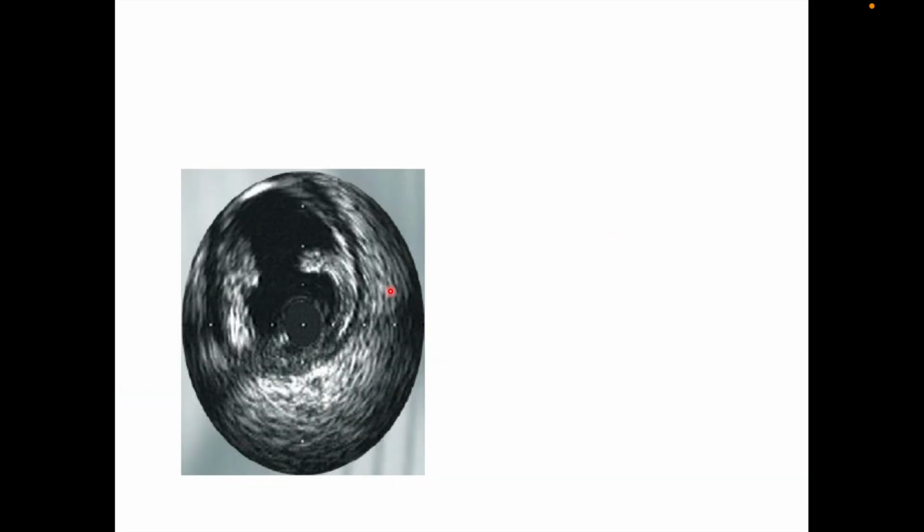So how do you identify dissection? Here, if you start identifying structures again, this is the IVUS catheter, and then from the IVUS start going backwards. This is the lumen. Around the lumen, this should be intima, going all the way around. Then the black line in between is the media, going all around circumferentially, and outside the media is the adventitia.